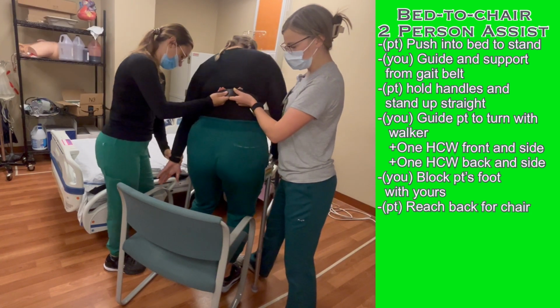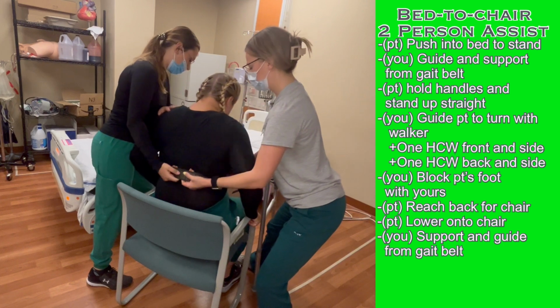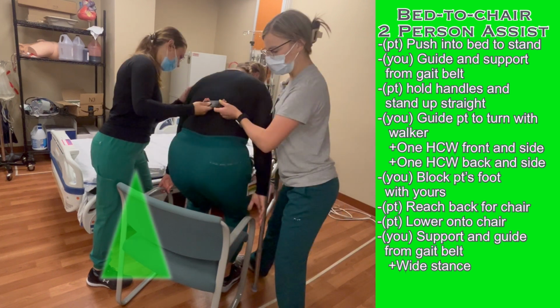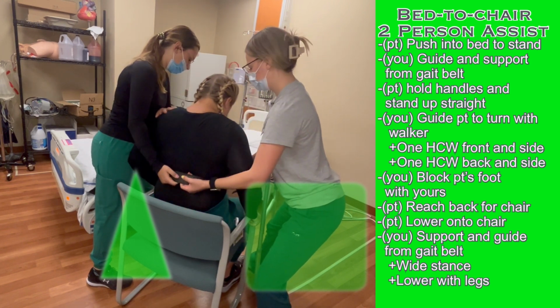Have the patient reach back to the chair and begin to sit, while the two of you guide the patient from the gait belt. Stand with a wide base of support, and as you guide the patient down, lower the patient by primarily using your legs, not your arms and back.